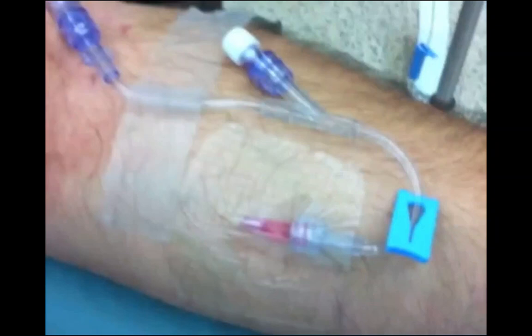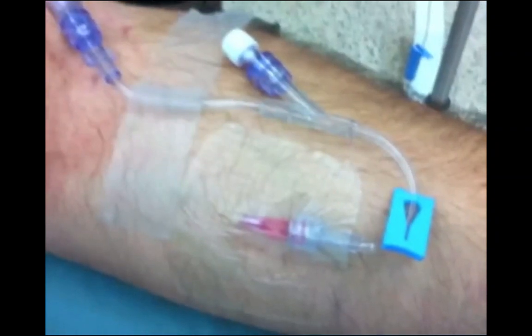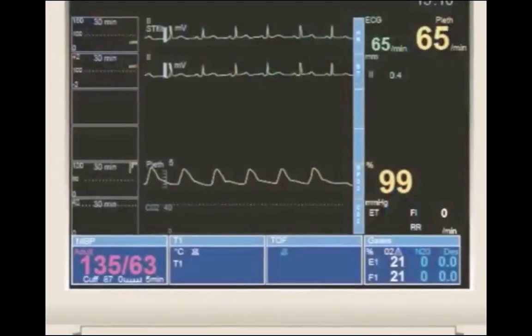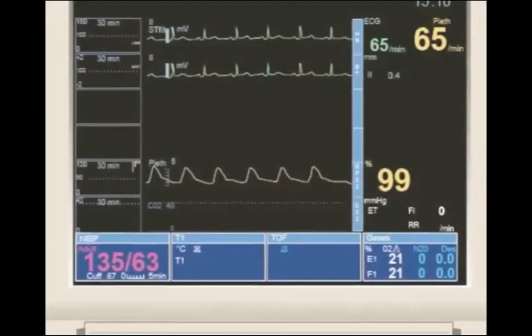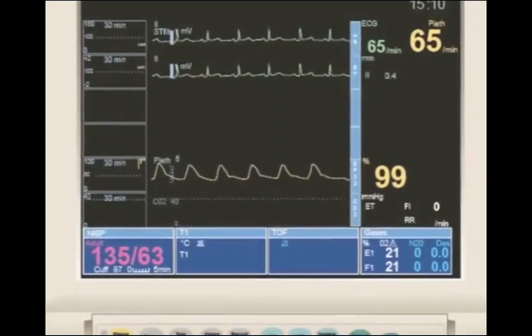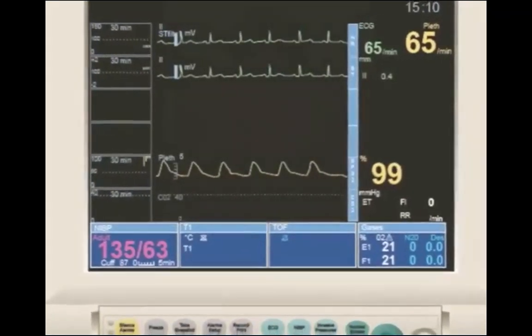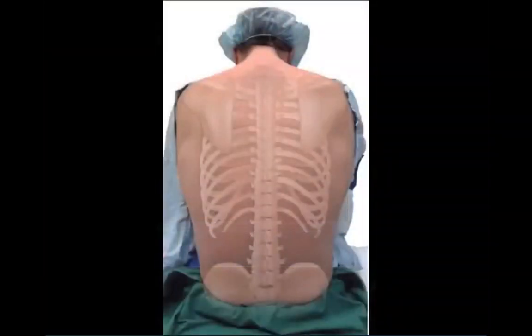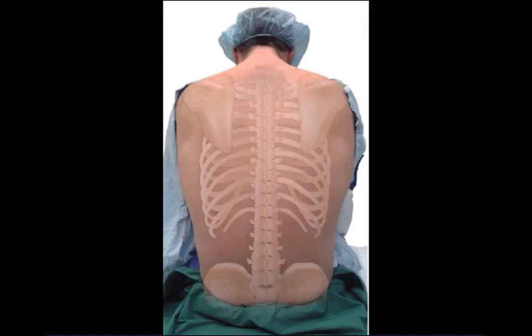Prior to performing epidural anesthesia, an intravenous is established and standard monitors including pulse oximetry and a non-invasive blood pressure monitor are applied. The patient can be positioned either sitting or on their side. The patient is instructed to curl and round their lower back to open the spaces between the spinous processes. The epidural space extends from the foramen magnum to the sacral hiatus.